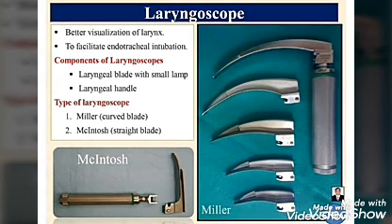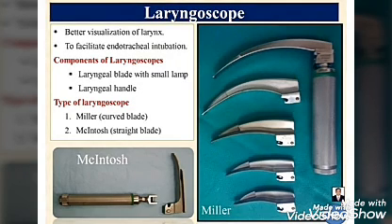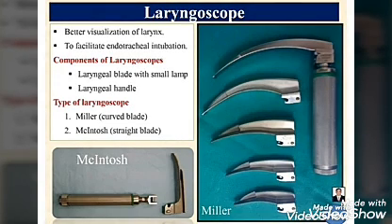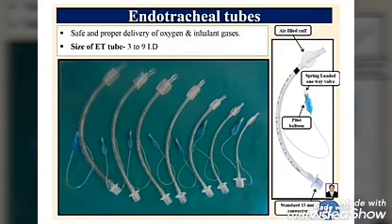By suppressing the epiglottis, the inner tube, meaning the lumen of the trachea, is very easily visible when you press the epiglottis with the help of the tongue depressor. The tongue depressor costs hardly 30 rupees and is very easily available in the human pharmaceutical market. Next one is the endotracheal tube.